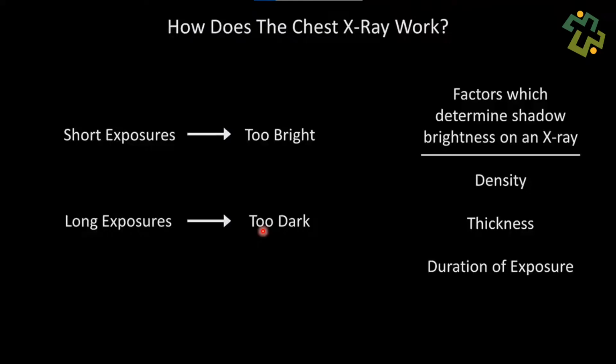Now, this is the opposite of what most people usually expect because intuitively we believe that all film starts off black and turns white after exposure to light. But remember, X-rays are the opposite.